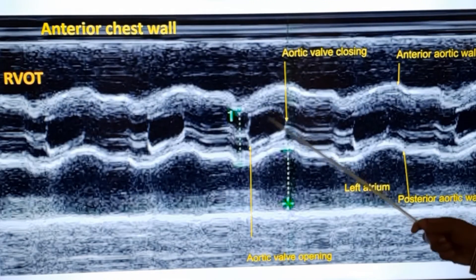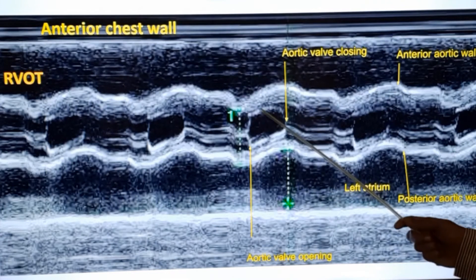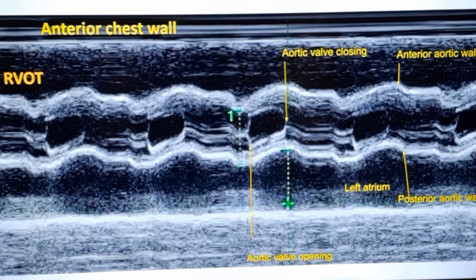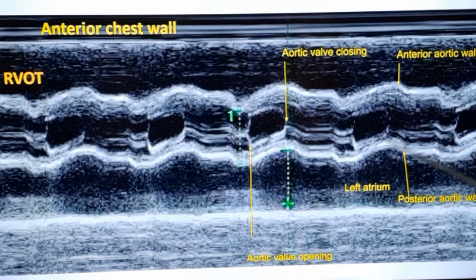Some hemodynamic information can also be gained from this view. The opening excursion will also give an idea about the cardiac output. In low cardiac output states, the opening excursions of the aortic leaflets will be lesser. Similarly, the movement of the aortic walls will also be lesser in low cardiac output states, because the aorta expands when a good amount of blood is pumped into it.